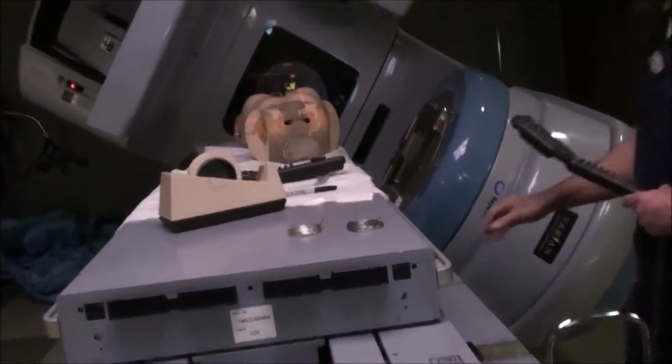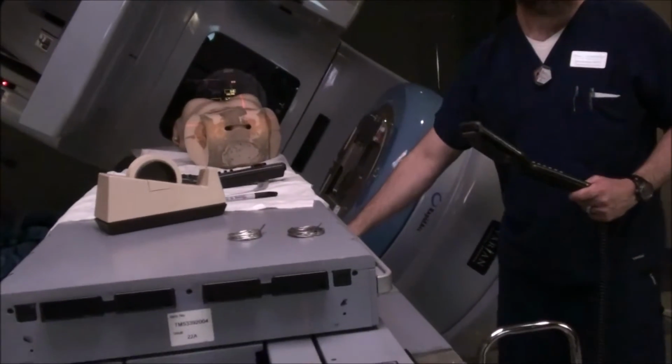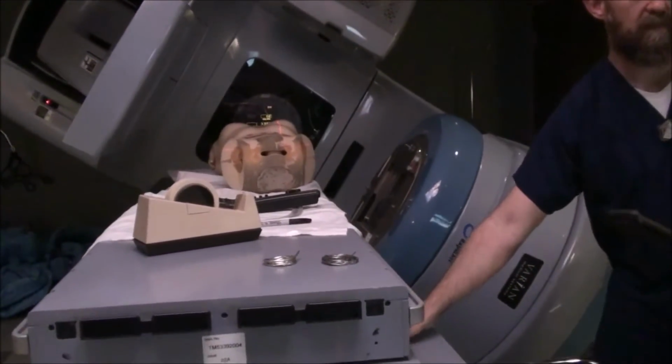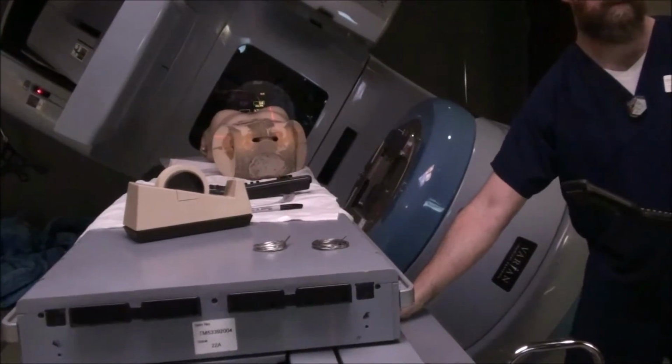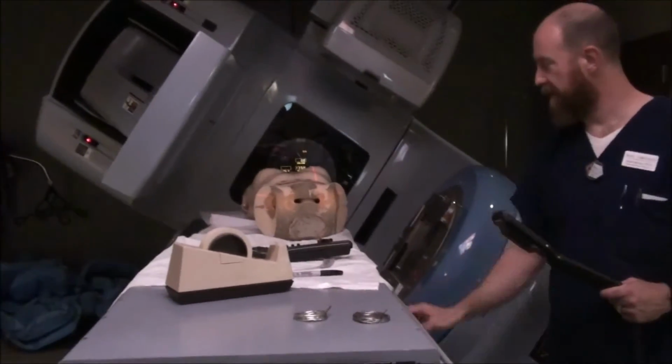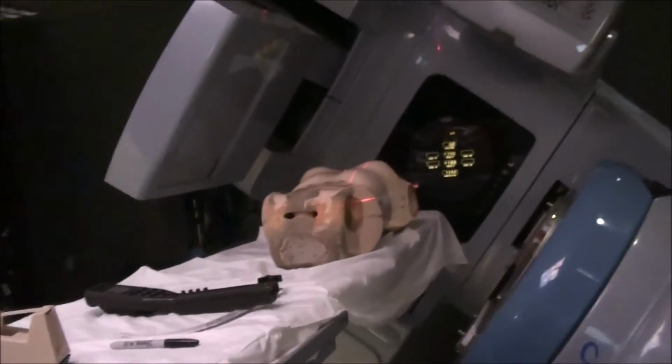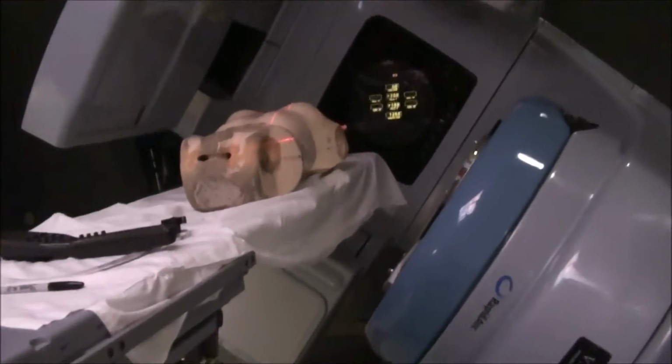Table keeps getting stuck. Okay. Now, we're going to say that that was our gantry angle.